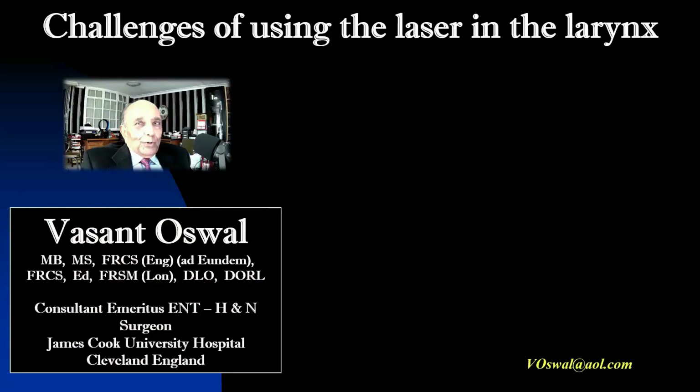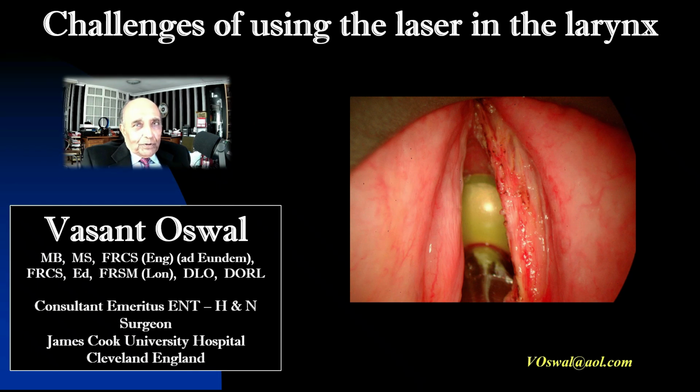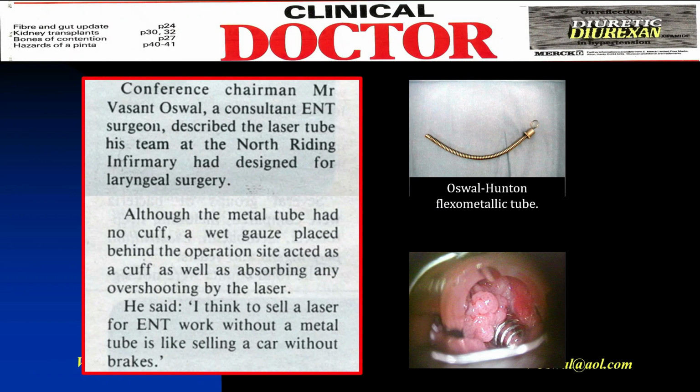However, using the laser in the larynx was challenging. For a start, we have flammable anesthetic tubes and high oxygen concentration. A hazardous situation should a laser beam strike the tube accidentally. Well, we overcame this by designing a flexible metal anesthetic tube.